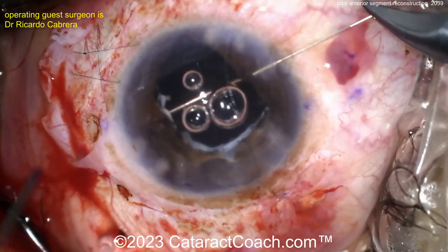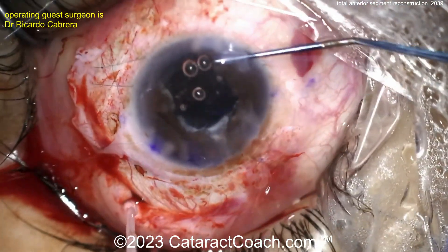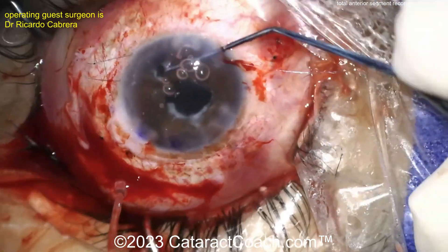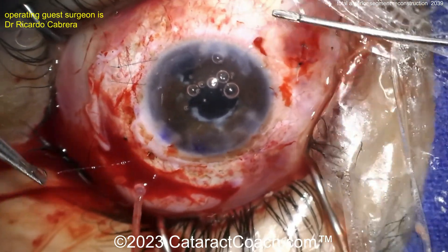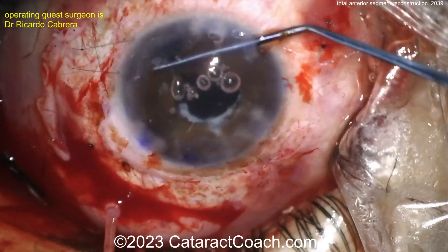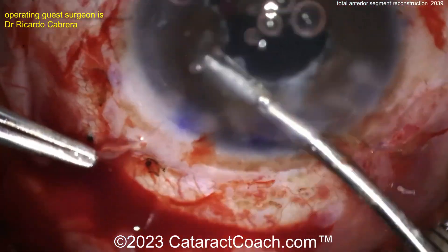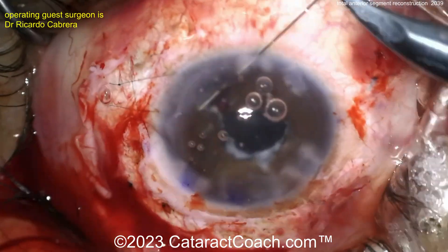Pupilloplasty now. This is a complicated case — remove the existing lens: done. Anterior vitrectomy. Scleral fixated new IOL with the Yamane technique. A glaucoma valve seton placed. And a pupilloplasty — all in one surgery. This is amazing. This is an incredible level of surgical technique and a very beautiful surgery.